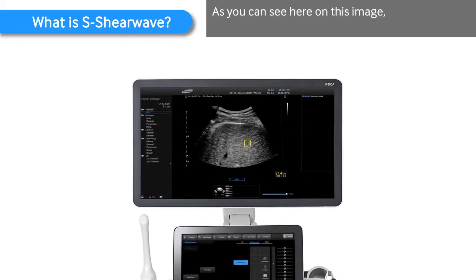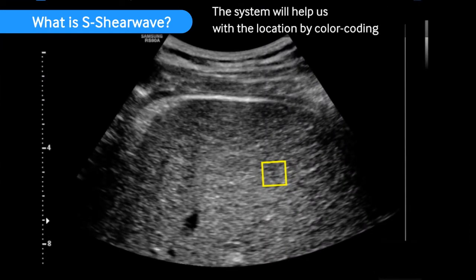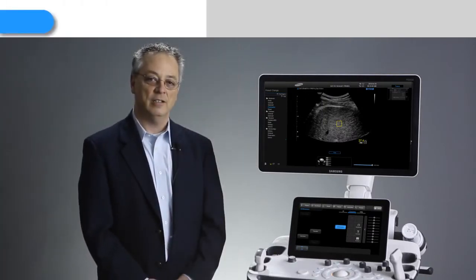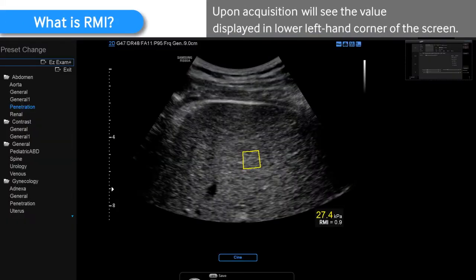As you can see here on this image, there's an ROI that's placed in the center. The system will help us with the location by color coding on whether or not it's a good location. Upon acquisition, we'll see the value displayed in the lower left-hand corner of the screen.